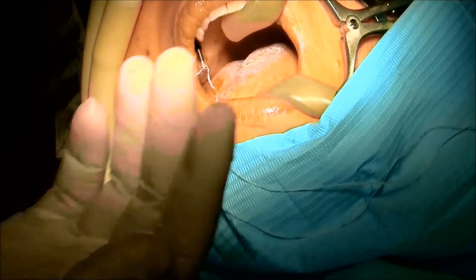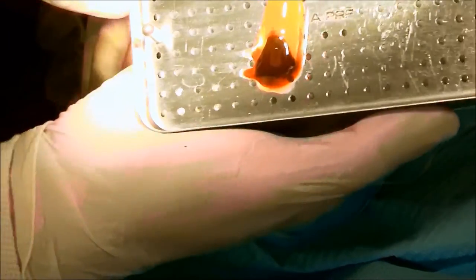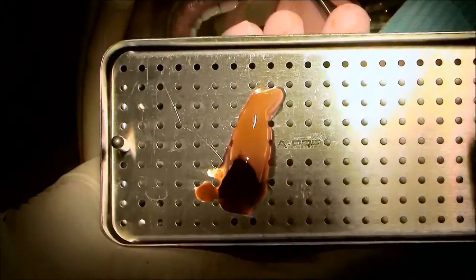Here I'm using the same osteotomy burr preparation, and we're going to go ahead and take an x-ray. Here is a presentation of the PRF membrane — this is the fibrin.